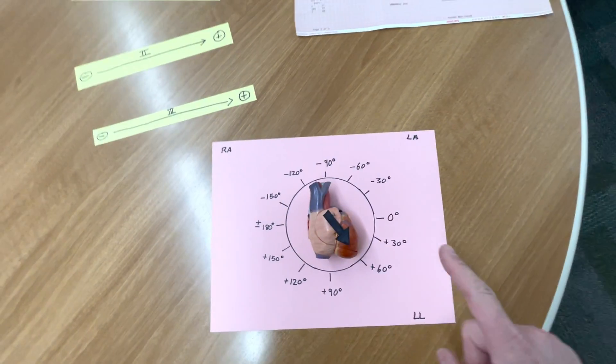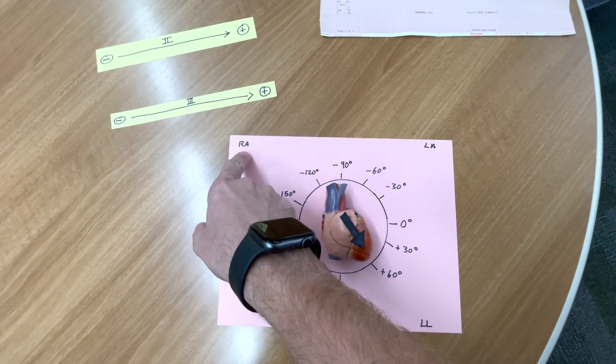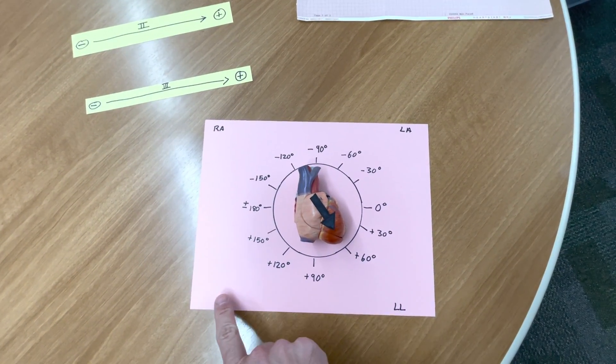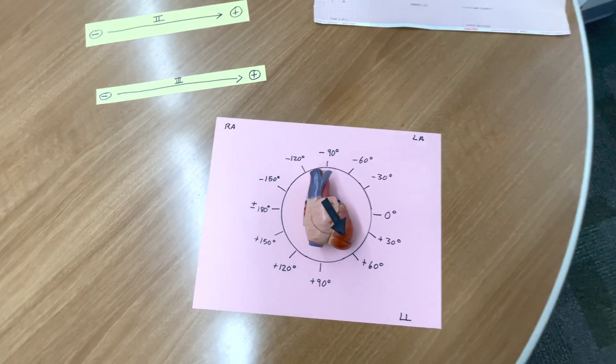The three limb leads more or less make a triangle around the heart known as Einthoven's Triangle. So, I have my electrodes. I have electrodes placed on the patient. The right arm electrode, the left arm electrode, and the left leg electrode. The RL, the right leg, acts as a ground.